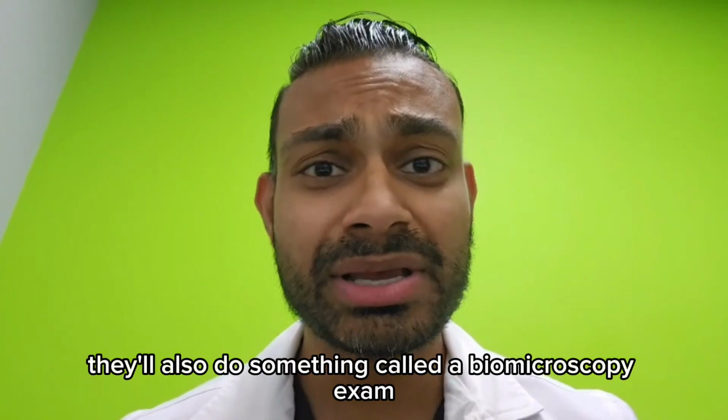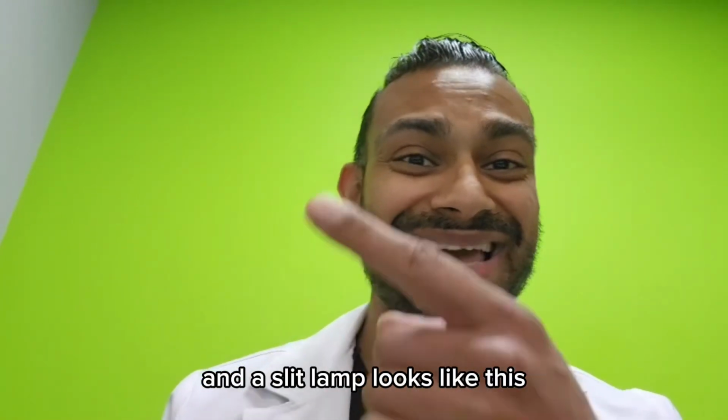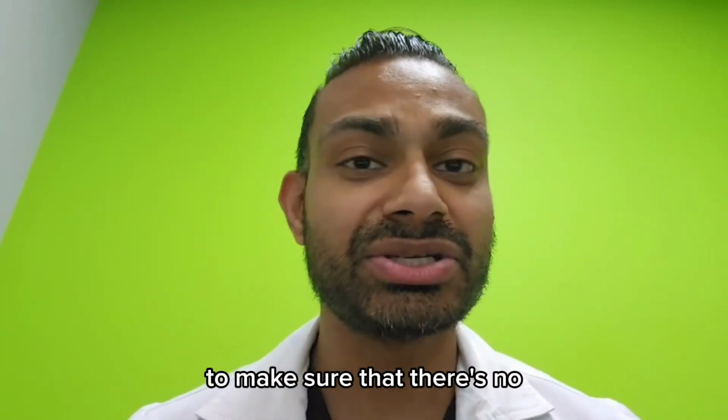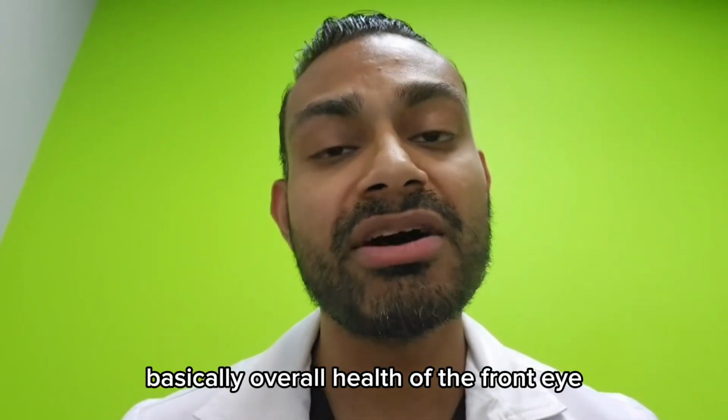They'll also do something called a biomicroscopy exam or a slit lamp examination. And the slit lamp looks like this. So this is the microscope that we actually use in the clinic to make sure that there's no diseases on the front surface of the eye, checking for dry eye, basically overall health of the front eye.